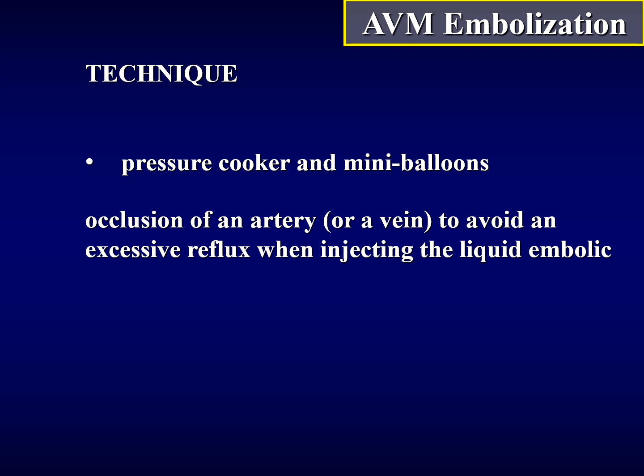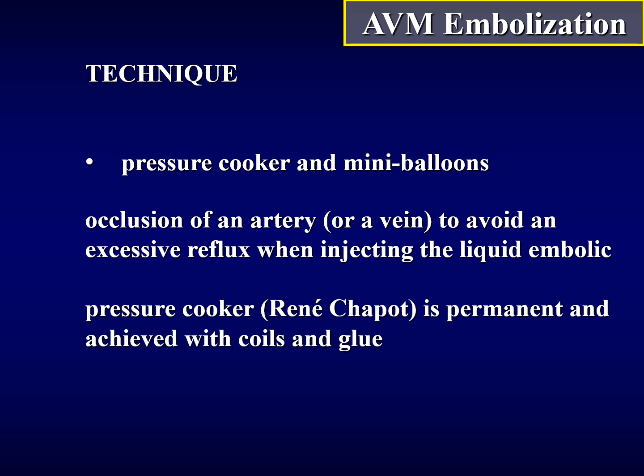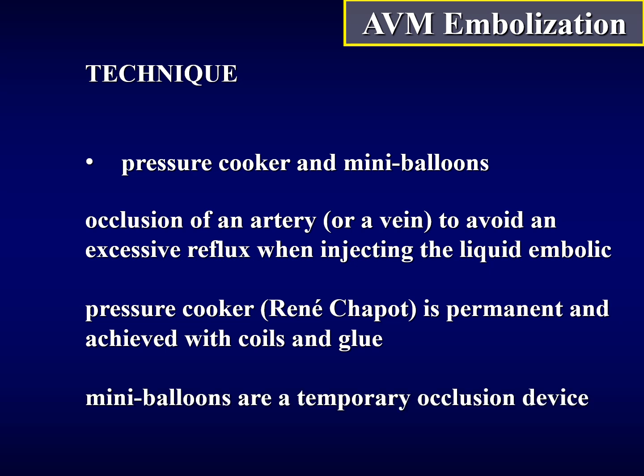It's the occlusion of an artery or a vein to avoid an excessive reflux when injecting the liquid embolic. René Chapot invented the pressure cooker technique, and with that you place coils and you add some glue in order to occlude permanently the vessel.